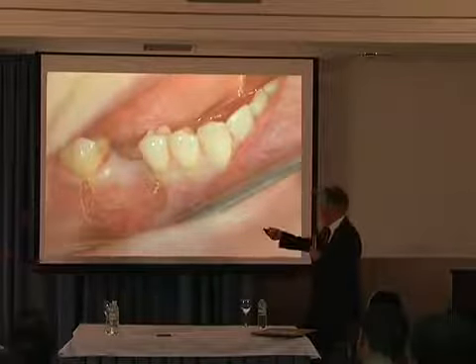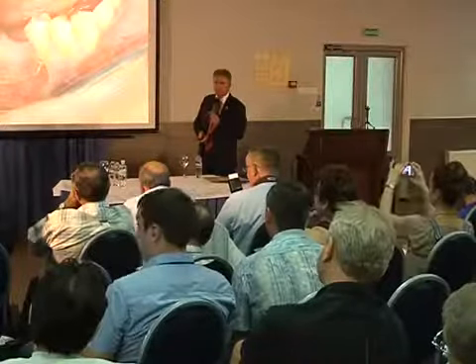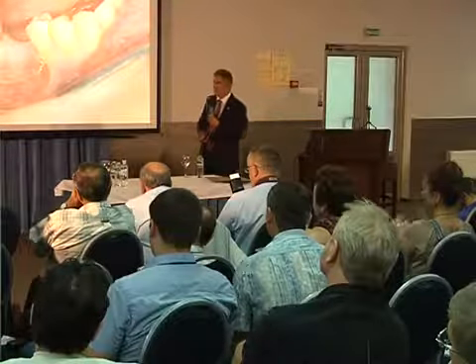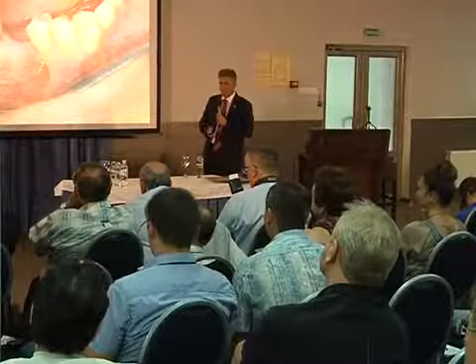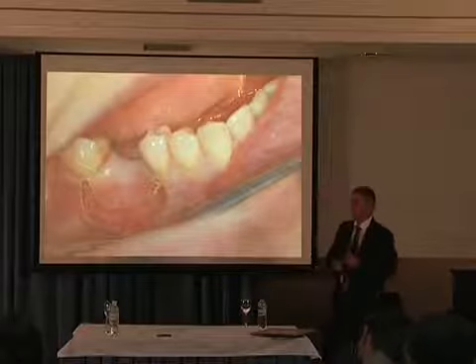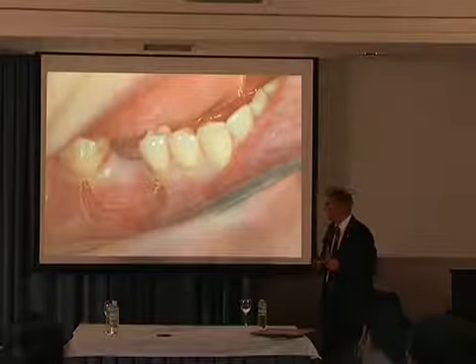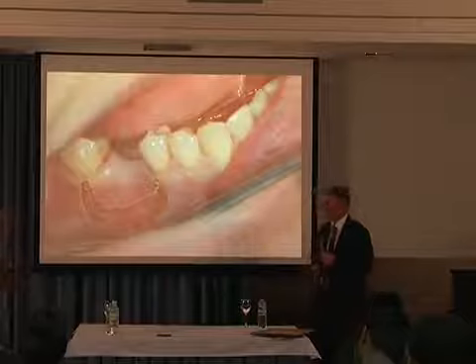Вопрос в том, что если мы сделаем разрез по центру альвеолярного отростка, потом будем заниматься расщеплением, то после того, когда мы поставим даже имплантат, сам имплантат и зона расщепления будут находиться по центру, где будут наложены швы. И, естественно, процесс заживления, регенерации будет идти под угрозой инфицирования или каких-то других проблем.